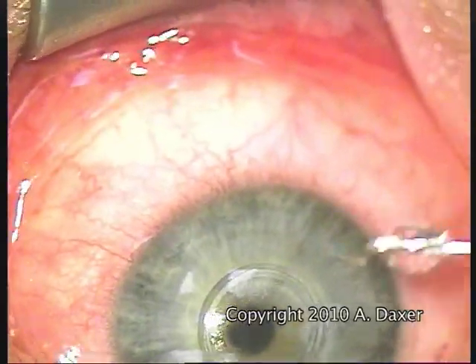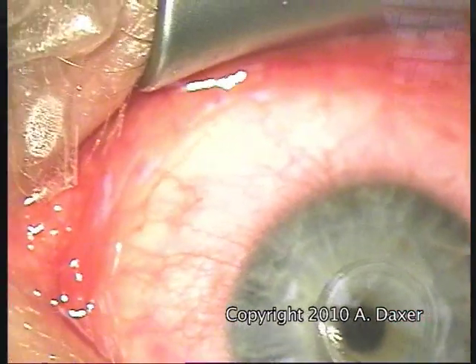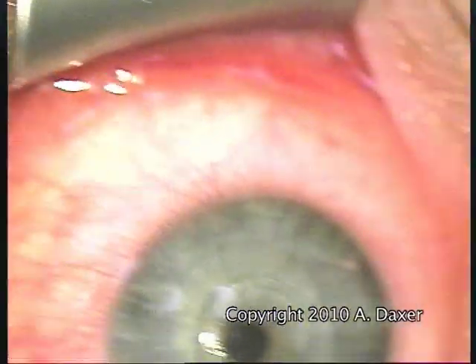The small tunnel is self-sealing and requires no suture. The small tunnel is closed all around and there is no suture.